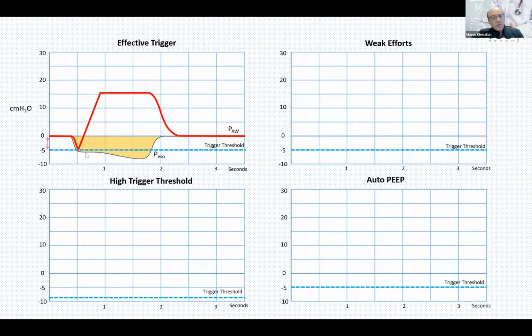You can see that the patient continues to breathe with inhalation, of course, at the same time as the machine is giving the breath. And it happened that the end of the breath is coinciding with the inspiratory time that you set on the machine.